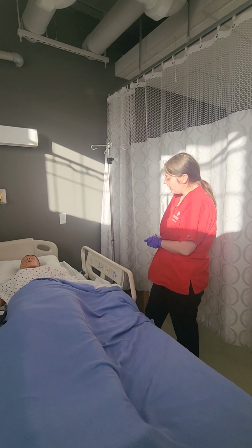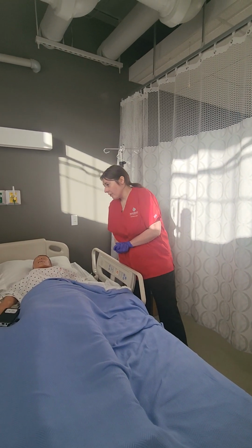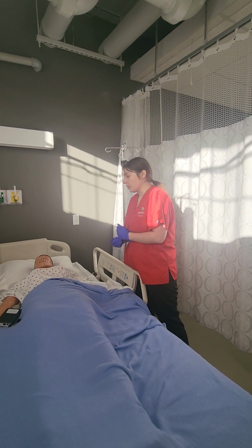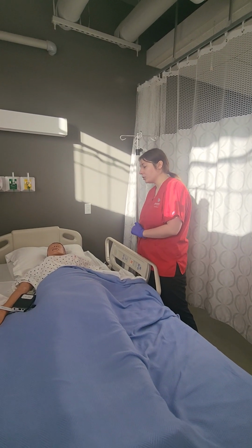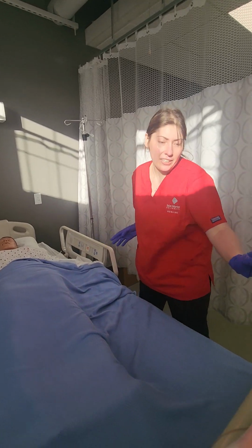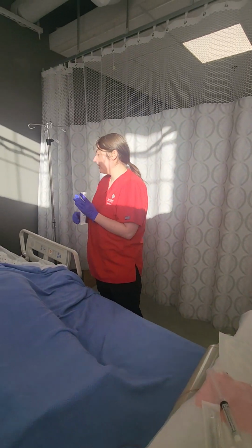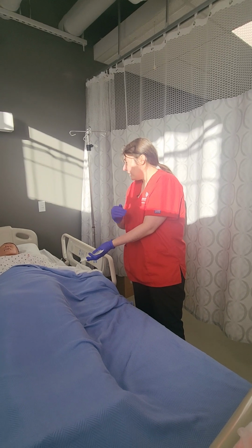Just double checking, you still have pain, 6 out of 10? Yes. Okay. Well, have you ever had an IV insertion before or blood draw? Yes, but is there a kind of explanation? Oh, sure. So what's going to happen is I got this catheter right here, and this has a little needle. It's going to insert into your vein, and that needle's going to go away.